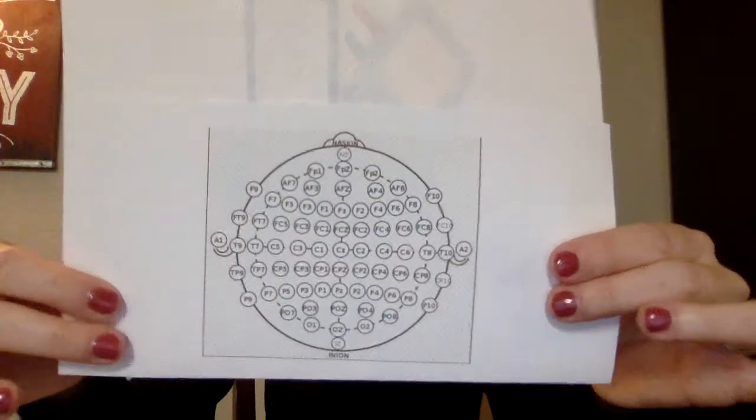So when we go back to this image, if you're trying to fit a certain electrode at a certain part of the brain, it's important that it's fitting exactly where it needs to in order for it to stimulate the right part of the cortex. So those are all the materials that you're going to need for tDCS.